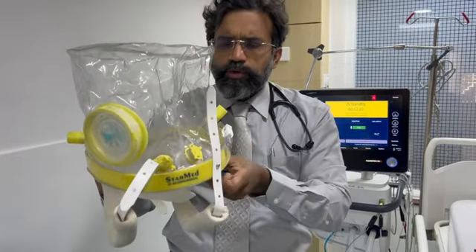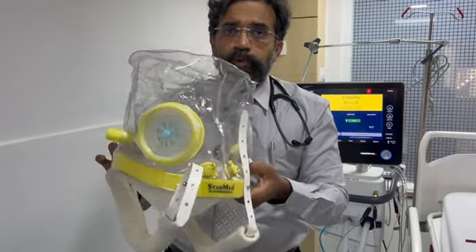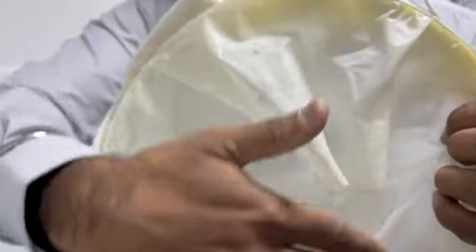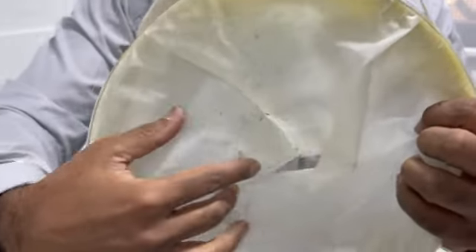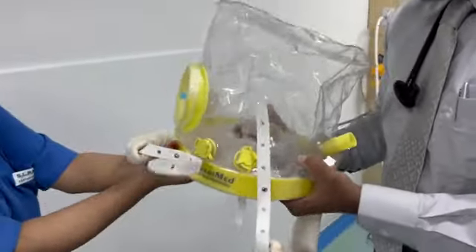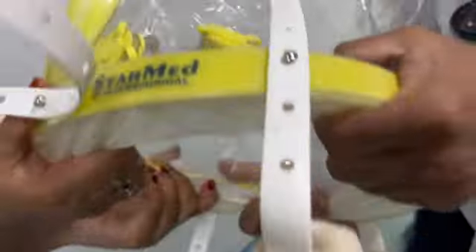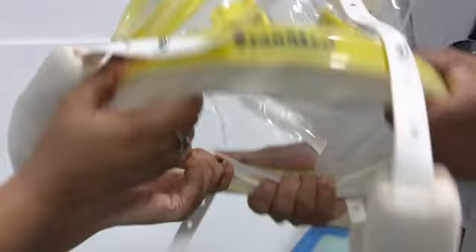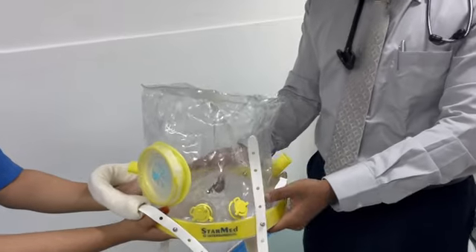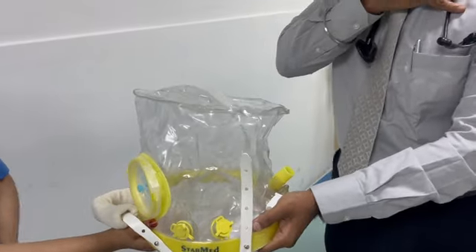In order to put this onto any patient, we require at least two people. Now if you look at the end over here, if you look at the inside, there is elastic over here which needs to be held by two people. So two people have to stretch it out, like how it's stretched out like this, completely stretched out, and then it has to be placed over the patient's head and then released. So once it's released, it fits snugly around the person's neck.